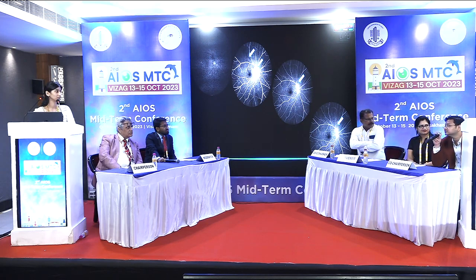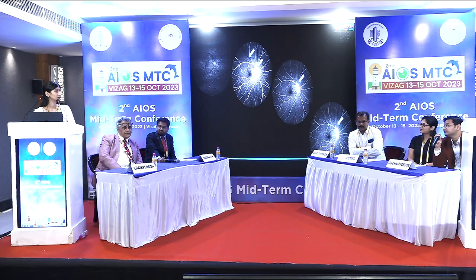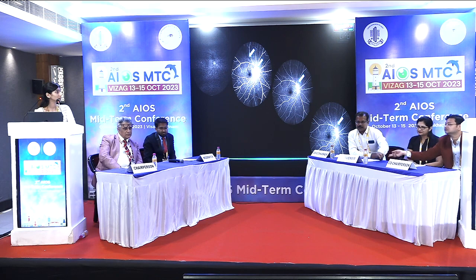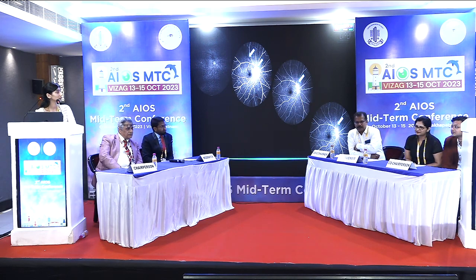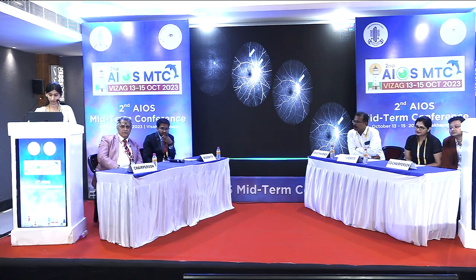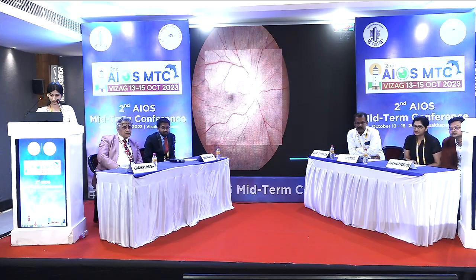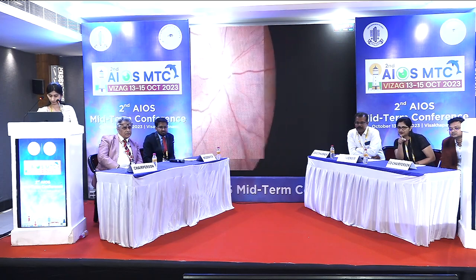How can we differentiate a plaque from a RAM? The plaque might be causing the BRAO. Blow up the picture where the macroaneurysm is. It's very interesting, it can coexist.